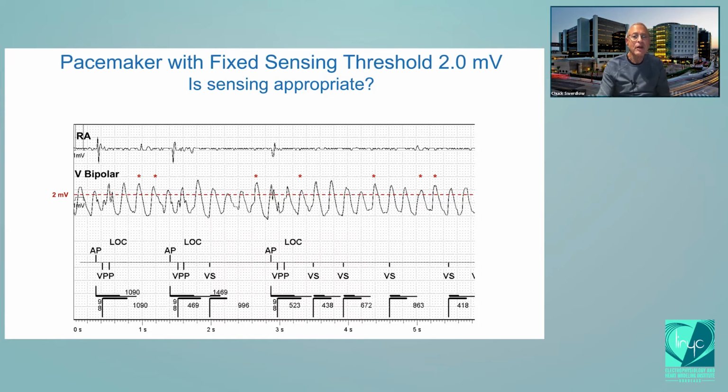So here's an example of a pacemaker with a fixed sensing threshold of 2 millivolts. And so we'll ask, do I have to call on the students, or who's going to volunteer? Is sensing appropriate or not?